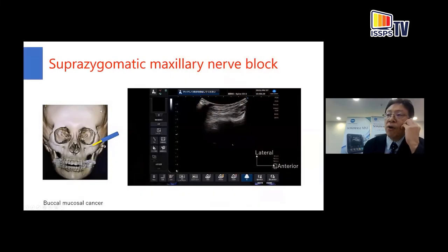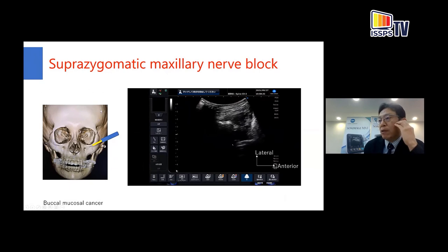When the patient has a limitation of mouth opening, the suprazygomatic approach is better than the infrazygomatic approach because we do not need the patient to open their mouth. Place the probe above the zygomatic arch and tilt the probe down to visualize the lateral pterygoid plate and maxillary tuberosity. In this approach, an out-of-plane needle technique is preferred because the window to access the injection point is very narrow.